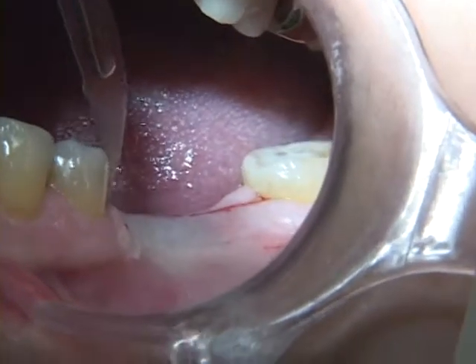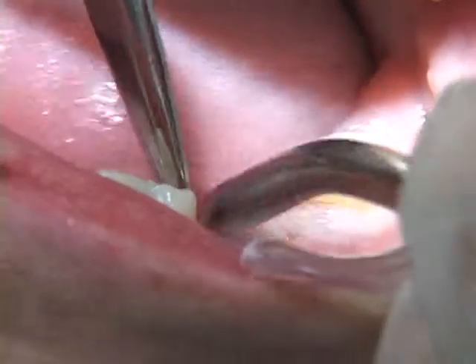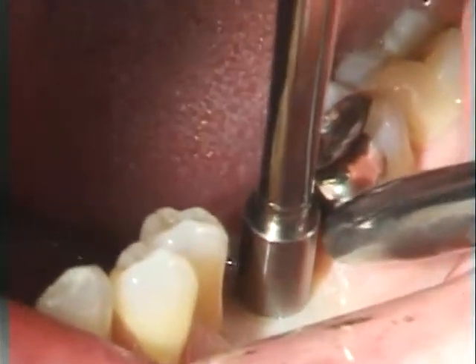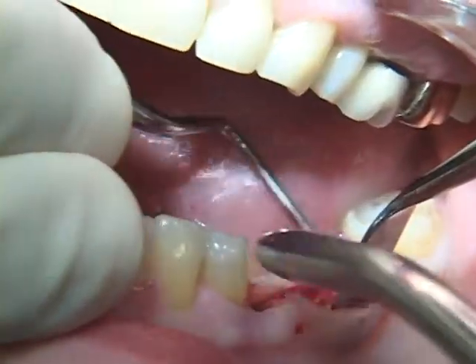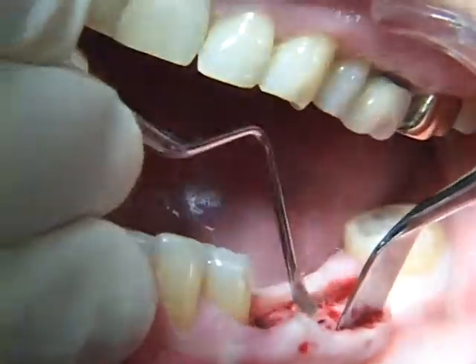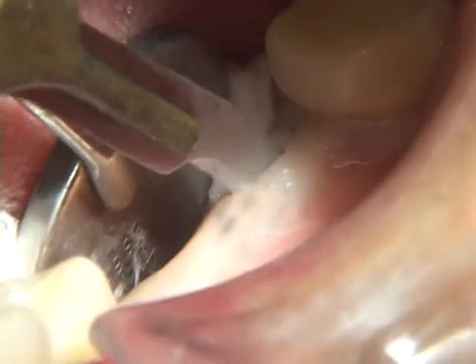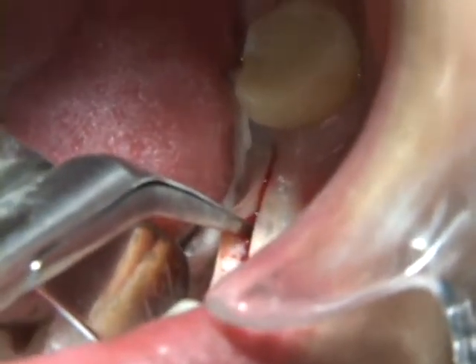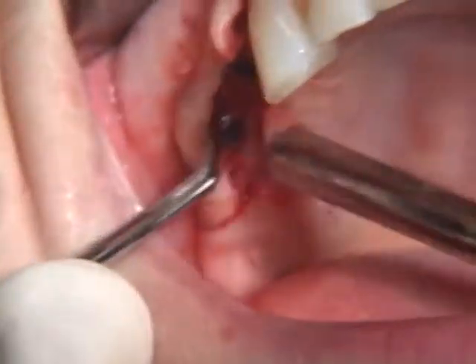After 3 or 4 months of appropriate healing for osseointegration, the implant is surgically uncovered. Although a tissue punch technique may be used for the uncovering if the implant can be readily located through mucosa, it is more desirable to use a flap procedure which preserves the buccal mucosa for the emergence profile of the intended abutment. In non-aesthetic areas, a slightly lingual or palatal crestal incision is made with only enough periosteal reflection to expose the black healing plug.